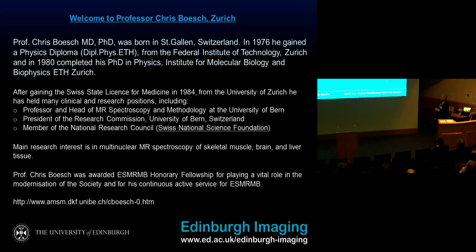And also choline is used for looking at the malignancy of tumors. Choline is actually the head group of phosphatidylcholine, and this can be used also via the membrane metabolism. You see on the left-hand side the total choline signal, which is often used for measuring the malignancy of breast tumors, for example. The problem is a little bit the technical one, because these authors very often use, if total choline is visible, then it's a sign for malignancy. On the other hand, the visibility of this signal is strongly dependent on the signal to noise. If you have more noise, you don't see your choline. And so the standardization is in the moment missing.